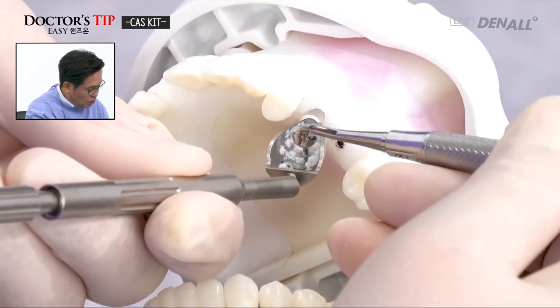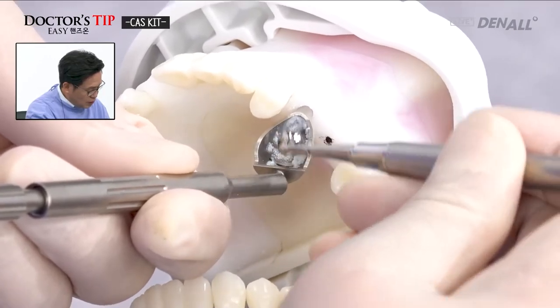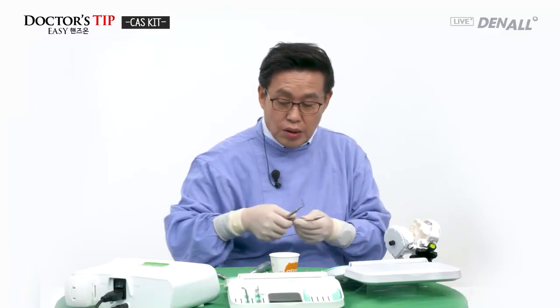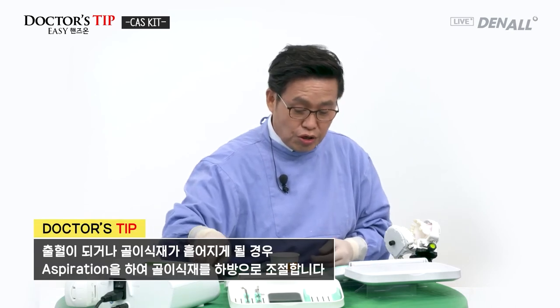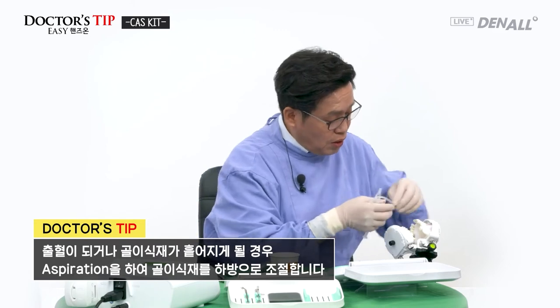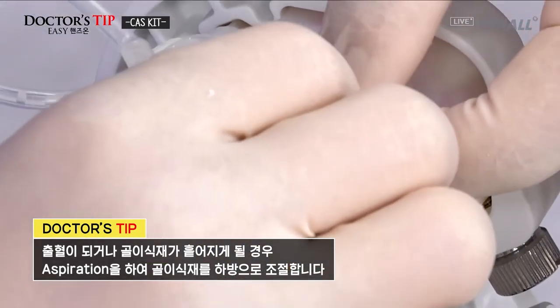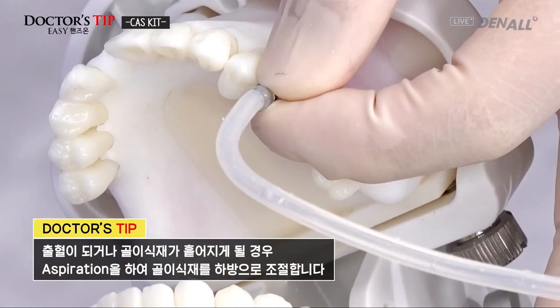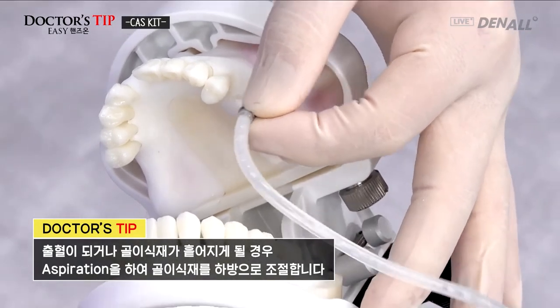Using the bone condenser, the graft materials are inserted. If internal bleeding occurs, the bone materials would be dispersed. So you use the hydraulic elevator and aspirate, and then the bone materials would come down.